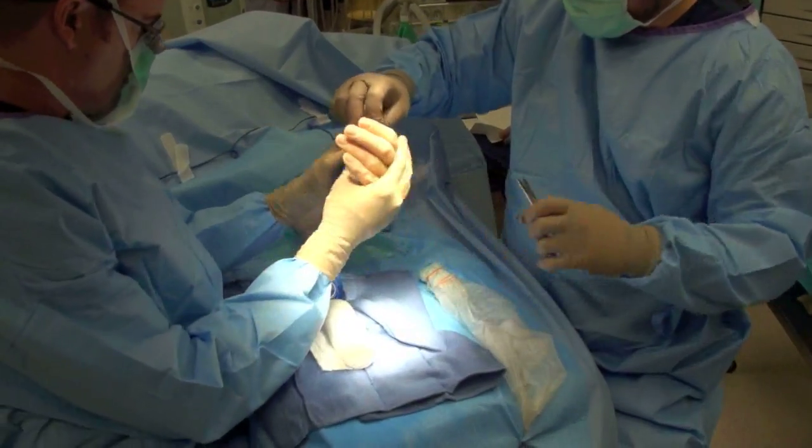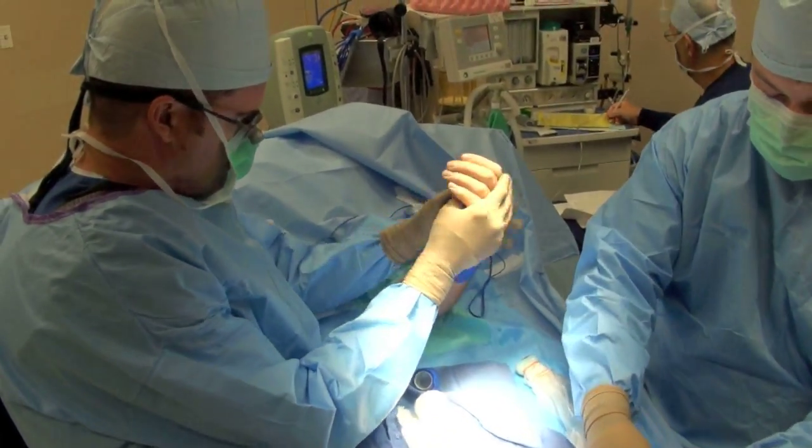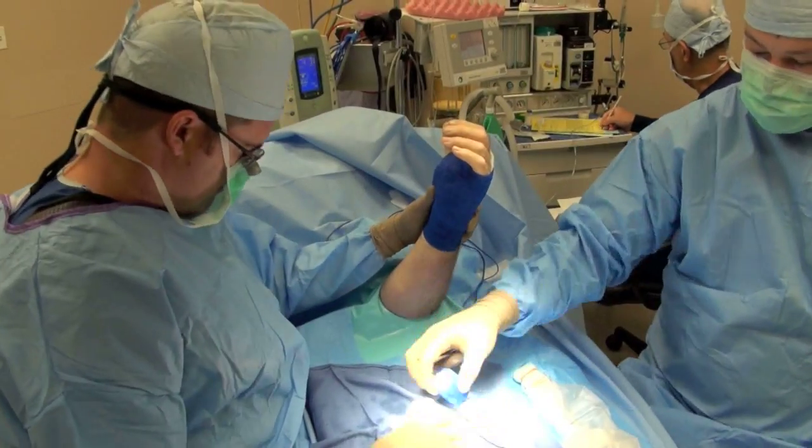That's the end of this surgery. I hope you enjoyed watching a removal of foreign body with ultrasound guidance. Please check out some of our other videos.